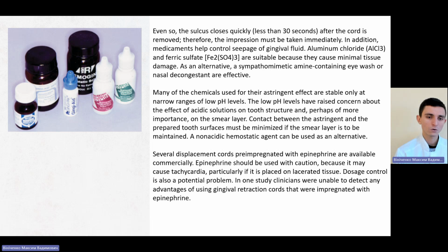Several displacement cords pre-impregnated with epinephrine are available commercially. Epinephrine should be used with caution because it may cause tachycardia, particularly if it's placed on lacerated tissue. Dosage control is also a potential problem. In one study, clinicians were unable to detect any advantages of using gingival retraction cords that were impregnated with epinephrine.